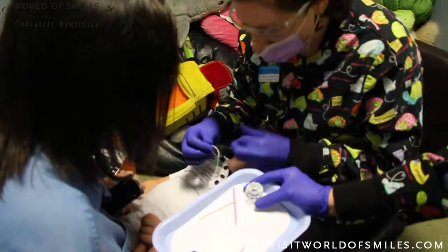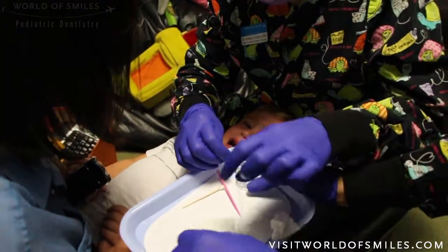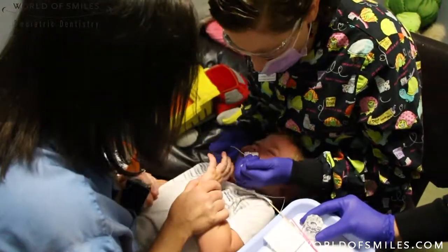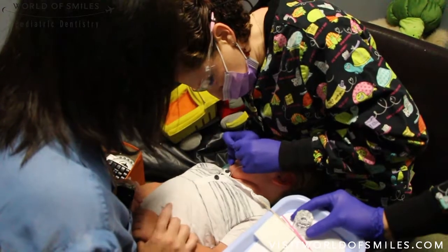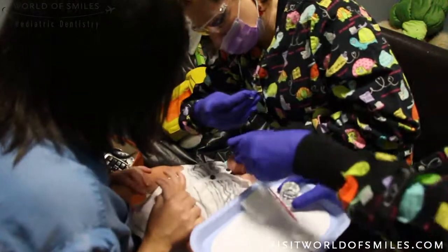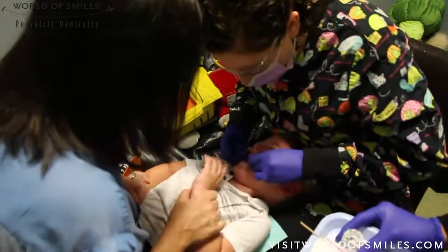If the child has an interproximal lesion, you can use super floss. This is a little trickier to avoid any contact with the skin, especially if the child is moving around. Try to keep the area isolated — you'll need to dry it and then quickly do the flossing between the teeth, keeping the floss out of the way.